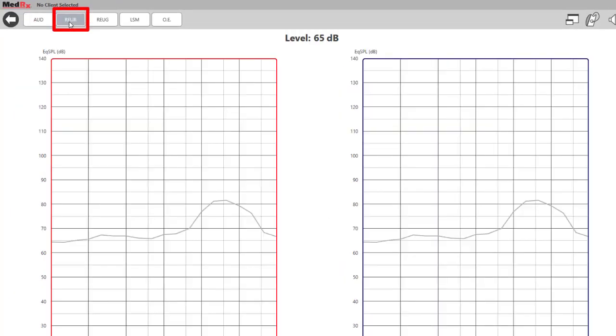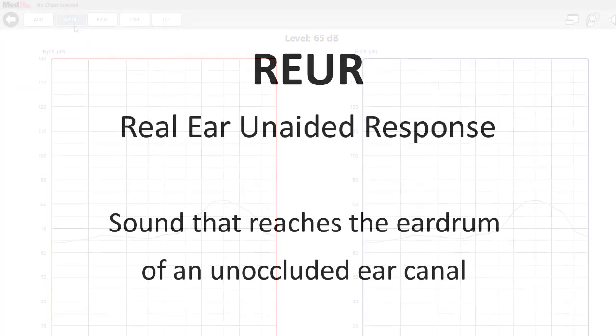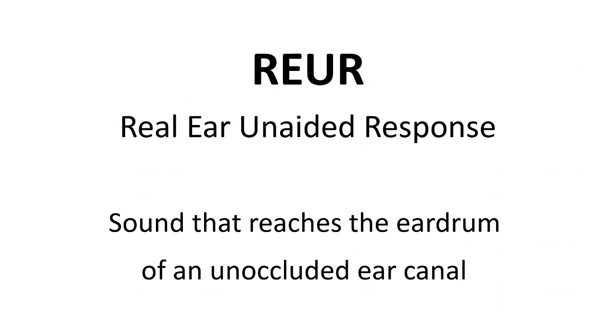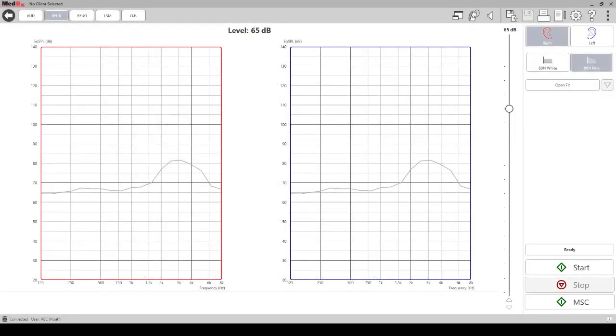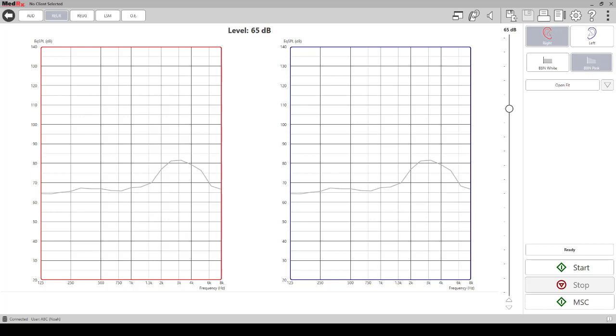REUR - Real Ear Unaided Response. The real ear measurement term for the sound that reaches the eardrum of an unoccluded ear canal is the real ear unaided response. This tab is where you can perform an REUR. The gray curve on this screen is the response of KEMAR or the standard ear response. Running an REUR on the patient is not required for LSM but is a helpful tool if you would like to look at the patient's unaided response and compare it to KEMAR. The results here will be displayed in EQ SPL.